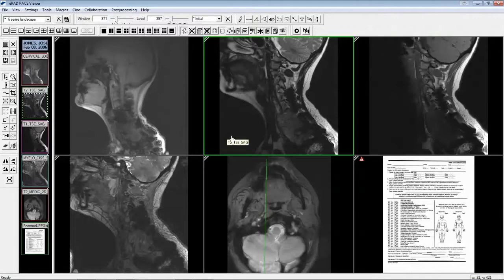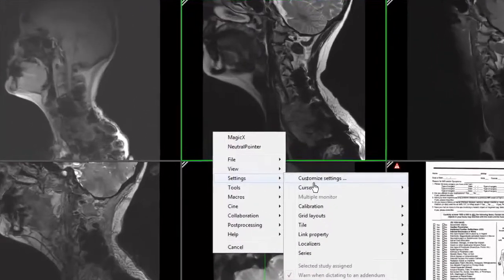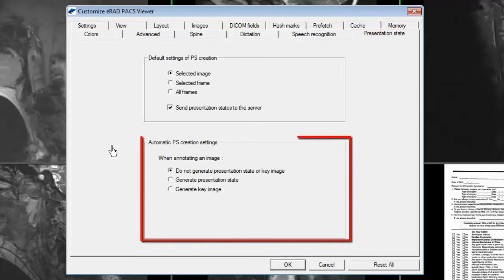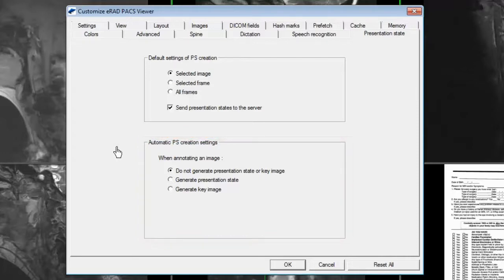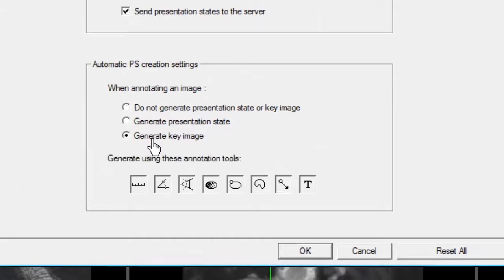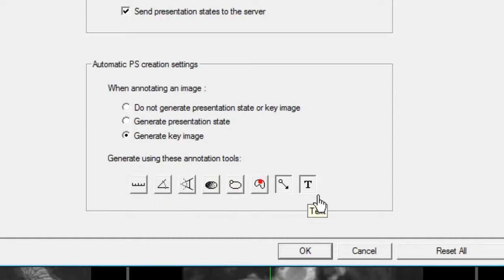In this version of the eRAD PACS viewer, you can automatically create a key image or presentation state based on a specific annotation tool. To configure this setting, go to the Customize Settings page and select the Presentation State tab. Notice you have three options on the lower half of this window. For this example, I will configure my user profile to automatically create a key image every time I use the pointer or arrow annotation tool. Notice all available tools are selected by default. Uncheck the ones you do not want to use.